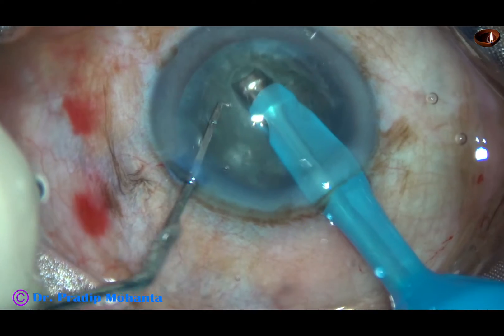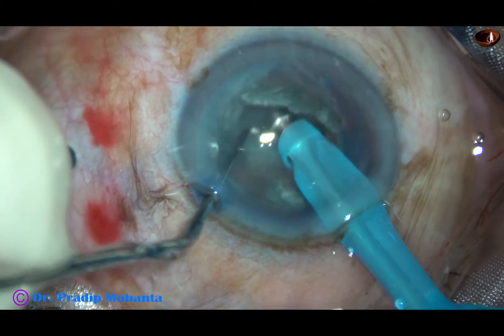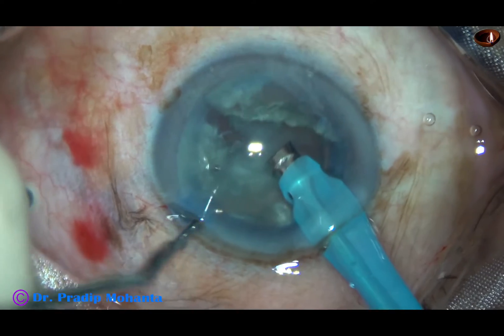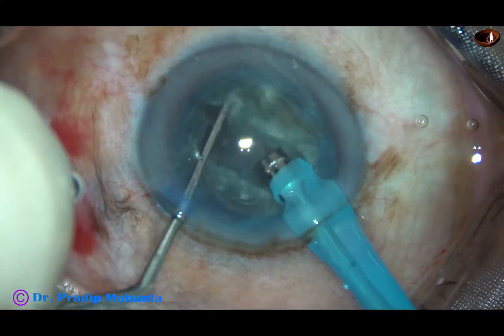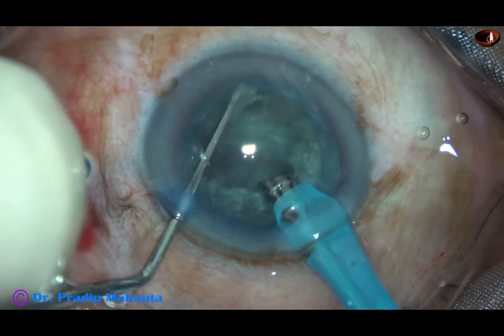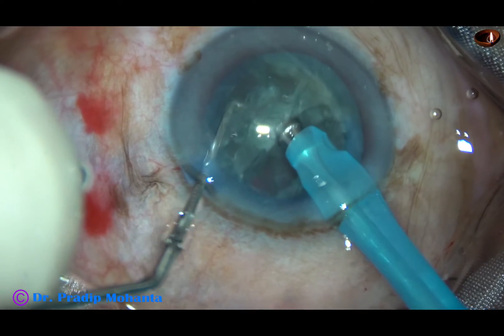I have rotated it 180 degrees to get a nice depth all around. The nucleus is being divided into two hemi-nuclei. The nucleus is completely separated — the hemi-nuclei are completely separated from each other.